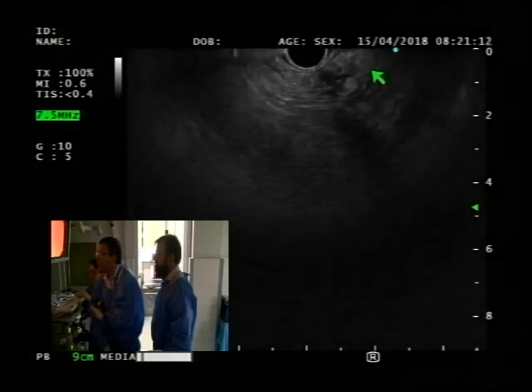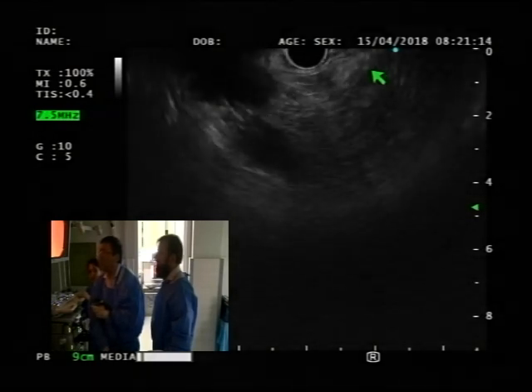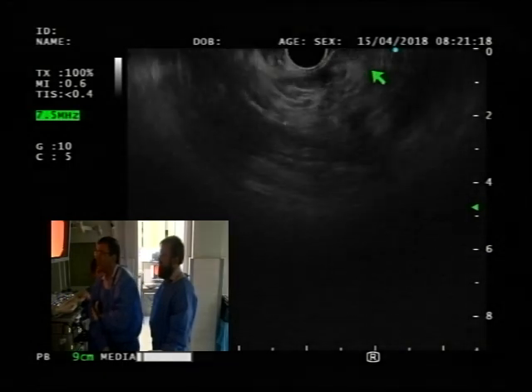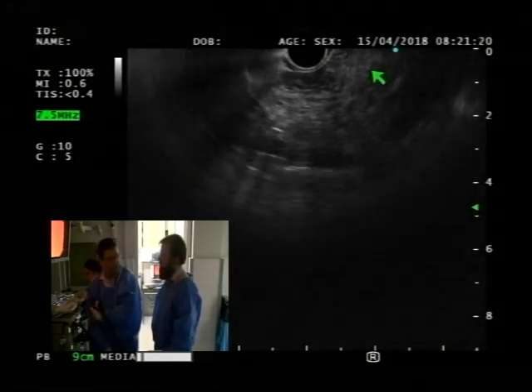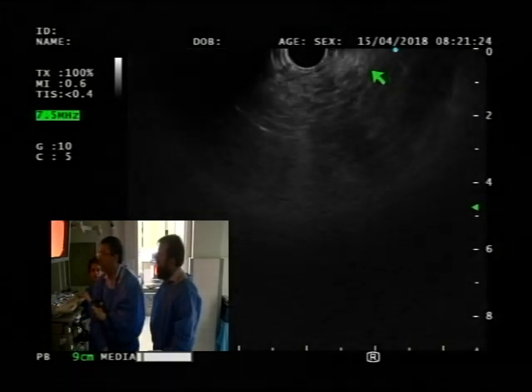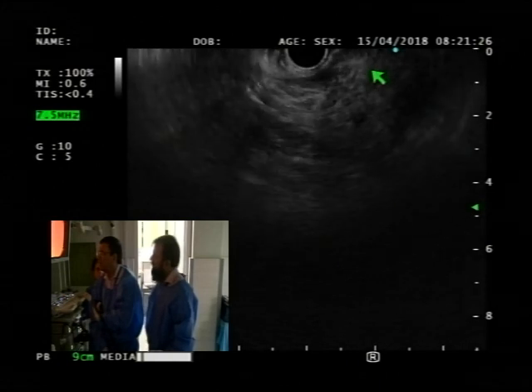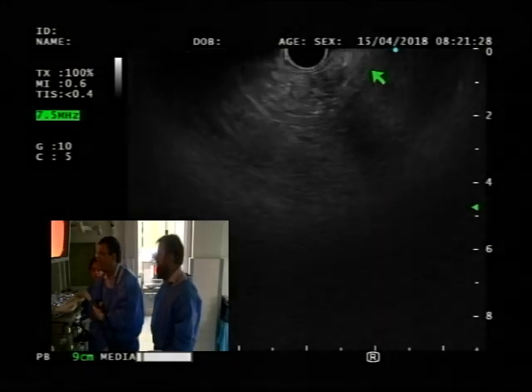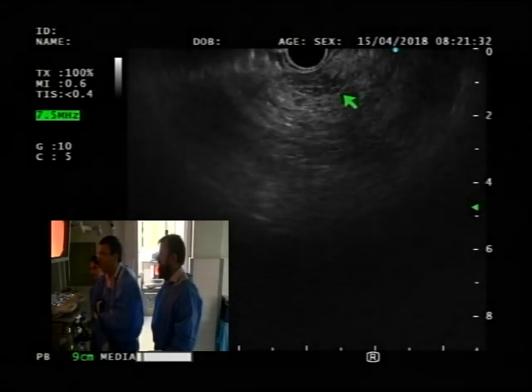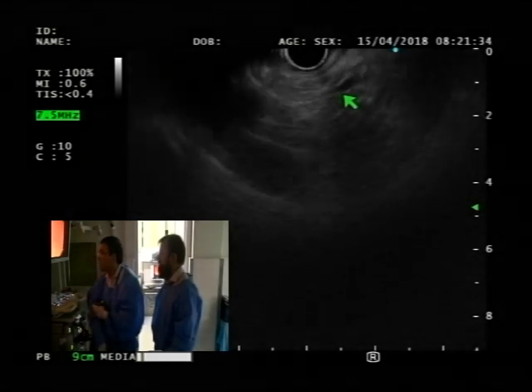Was it on the CT they said there's a mass? But there is a clot in that portal vein. So what I'm wondering is, if they are seeing that, where did they say in the CT, in the head of the pancreas, right? Body, distal body. I haven't seen the CT here. In the distal body, that's what they told me. Okay, so here at least we don't see the mass for sure. So did they say distal body, you said?